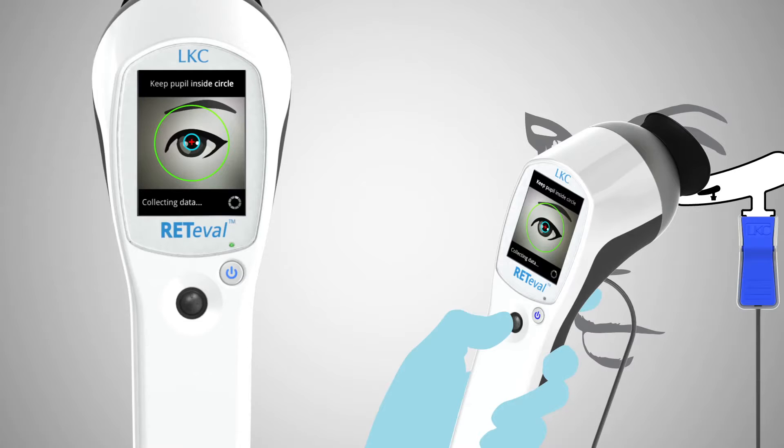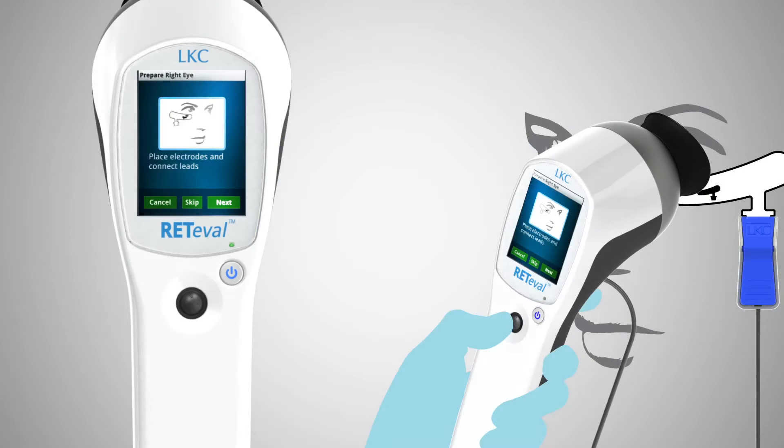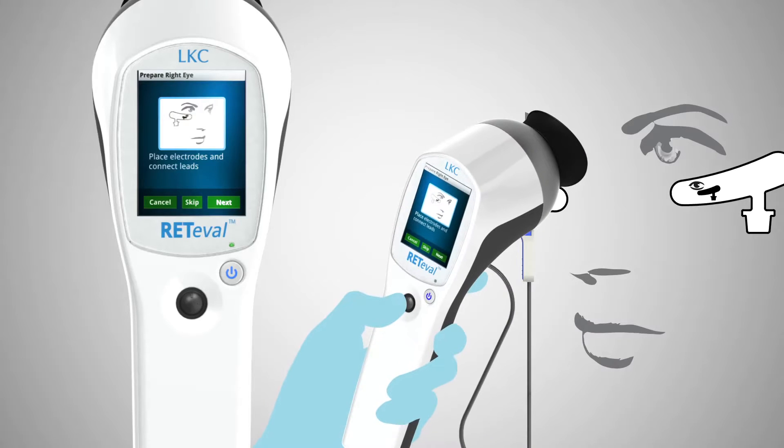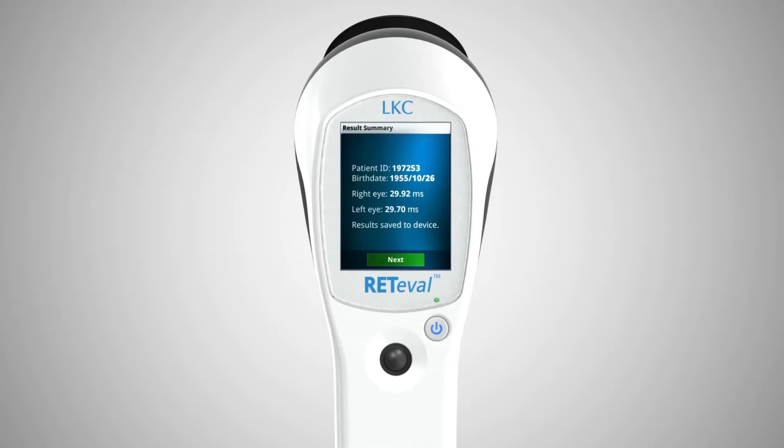The operator will continue to see the eye throughout the test, which typically lasts five to ten seconds. Reteval will indicate when the test is completed. Repeat the procedure on the companion eye. Results of the test are shown on the Reteval display.